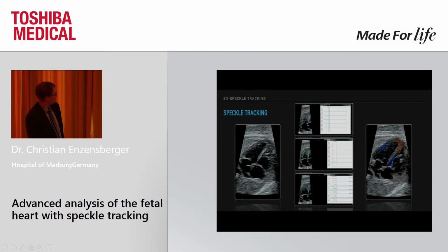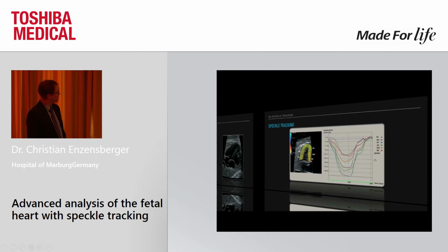And I think you will agree when you see that this tracking is really synchronous to the movement of the fetal heart.